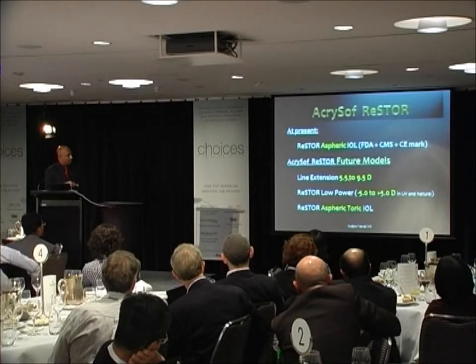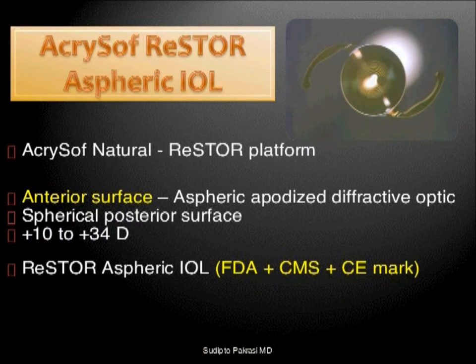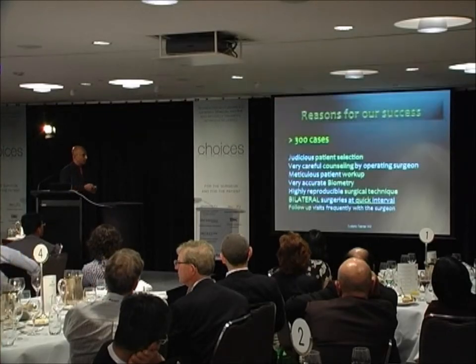And what's expected in the future, probably by next year, from what I've been made to understand, are a 5.5 to 9.5 line extension, low powers of the Restor, and an aspheric toric IOL. Now, two slides to tell you that unlike the IQ, where the asphericity is in the posterior surface, in the aspheric Restor it's in the anterior surface next to the rings. Whereas in the aspheric toric IOL, the anterior has the apodized aspheric diffractive optic, while the toric is in the posterior surface. That's what the lens is going to look like.